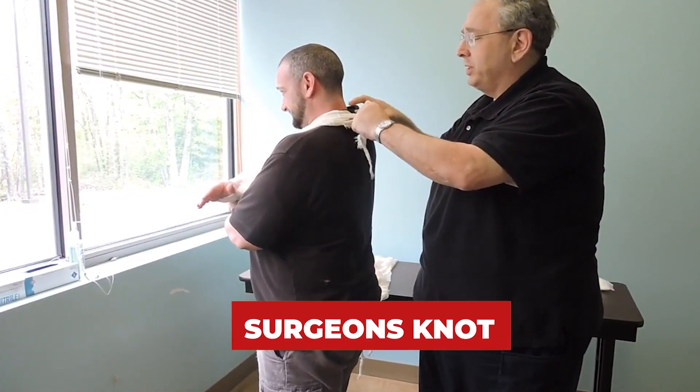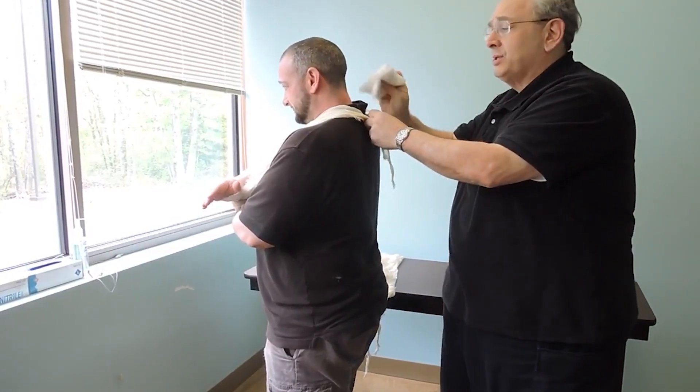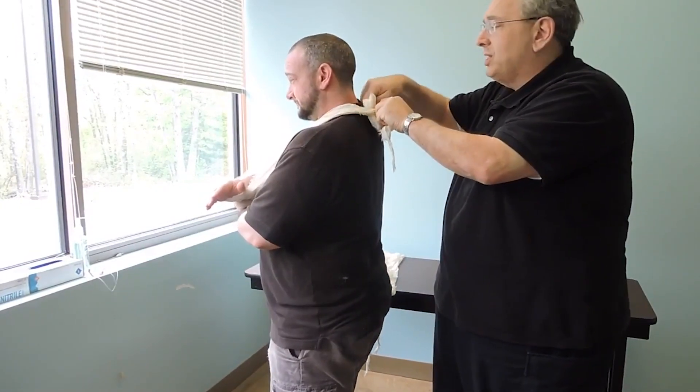I'm going to tie it, put it through once, put it through a second time, and I'm going to put a piece of padding under there so that the patient doesn't feel discomfort from the knot.